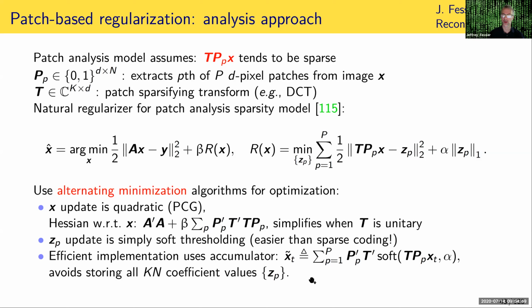This turns out to be important for deep learning methods. Question about how big are you thinking of the patches? That is the $1 million question. I think it depends on how much training data you have and how much memory and time you have. And let me get to that in a minute. Okay, it's a great question.